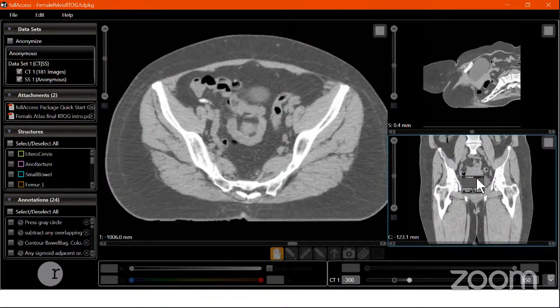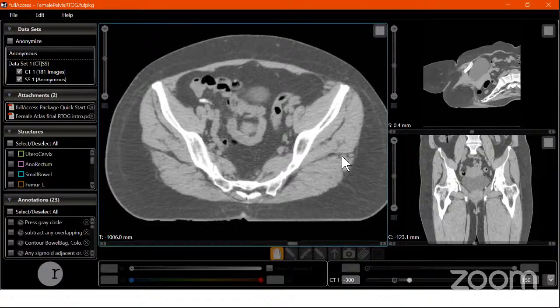So involvement of the lateral inguinal group of nodes is very rare or quite unusual. But the guidelines say that we need to contour the entire inguinal region when we include them in our treatment protocol. The places where we include them are when an inguinal node is obviously involved, or when the lower half of the vagina is involved by the tumor. So these two are the scenarios where we will include inguinal nodes.